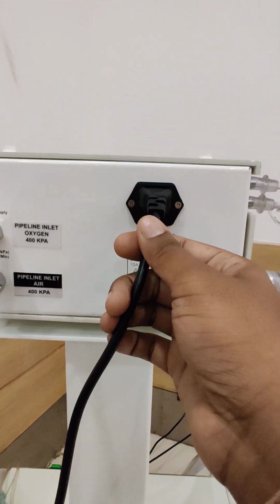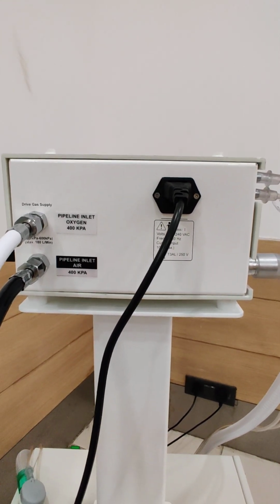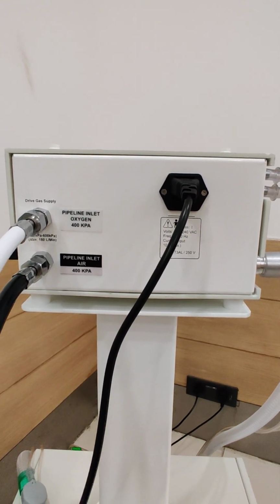And this is the mains AC power supply. This is the power cord connector over here, which is connected to the mains AC 220 volts of the hospital.